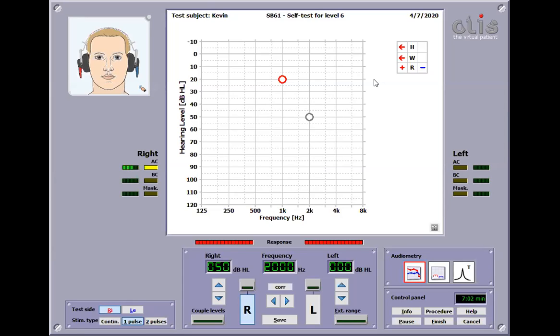Oh, what am I doing? Okay. Wait, what? Okay, yeah, right. Okay, that is our first ascending. It's our first ascending of 55 dB. So we had first ascending for both 50 and 55. Okay, that was our second ascending for 50 dB. All right, because there's more than a 20 dB interfrequency gap, we will have to test 1.5K, the interoctave frequency.